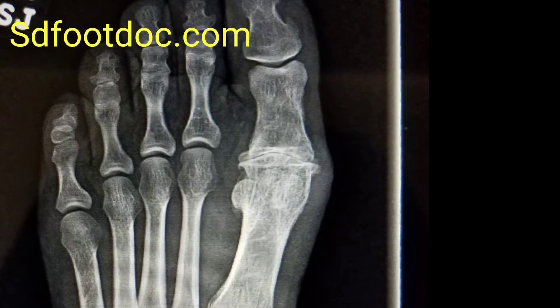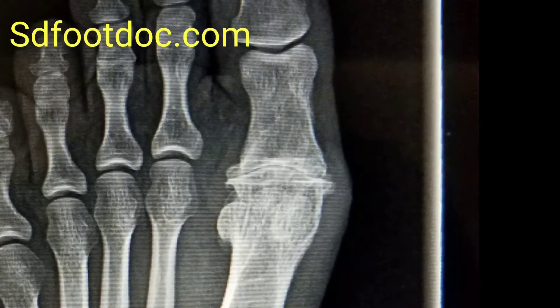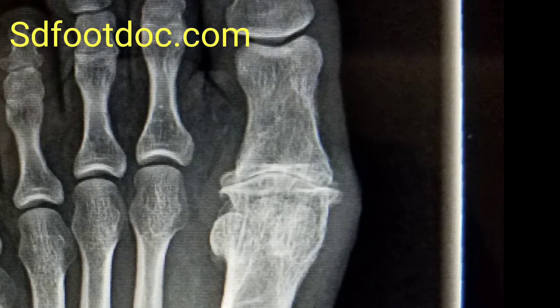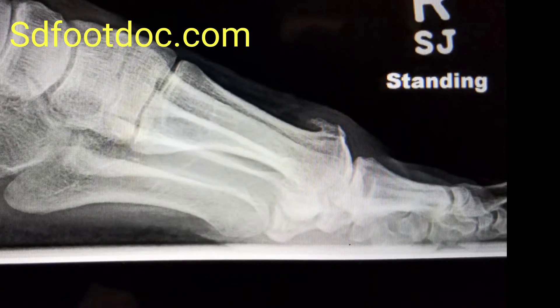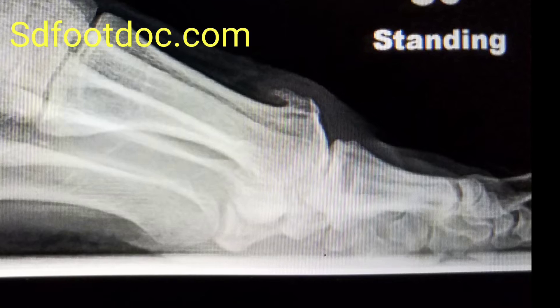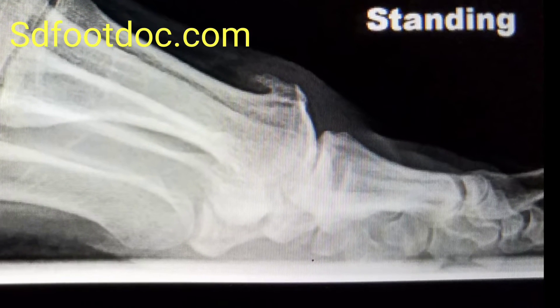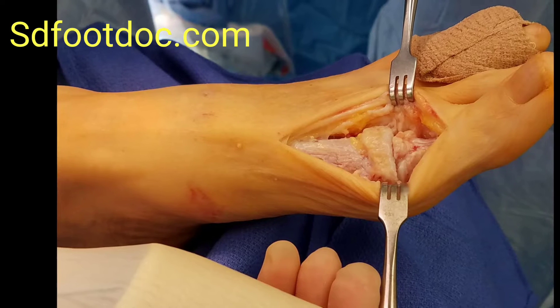Here you can see a diseased first metatarsophalangeal joint with total joint destruction on the big toe. Over here you can see a large spurring, called a dorsal osteophyte, with very limited range of motion. Painful big toe every step — sharp shooting pain while walking.